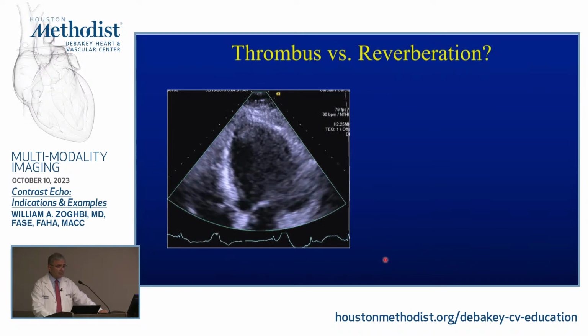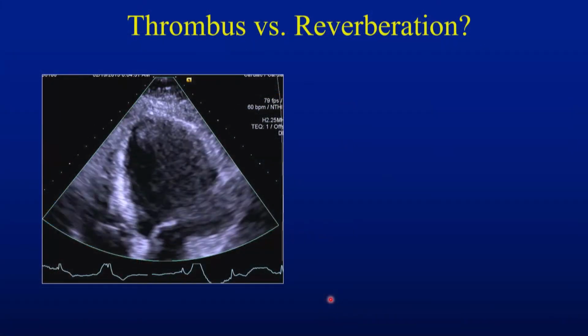All right, this is a quiz for you. Thrombus or reverberations?